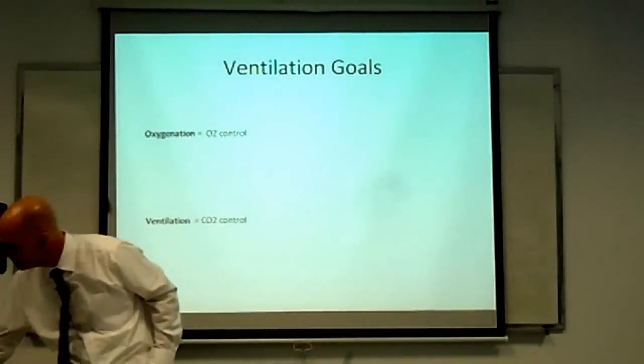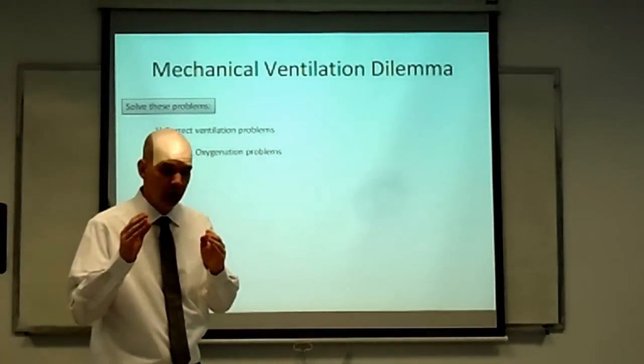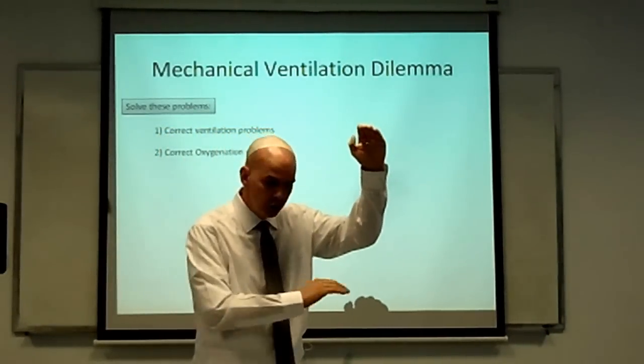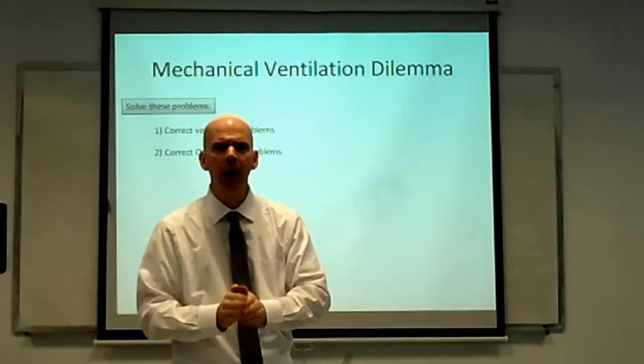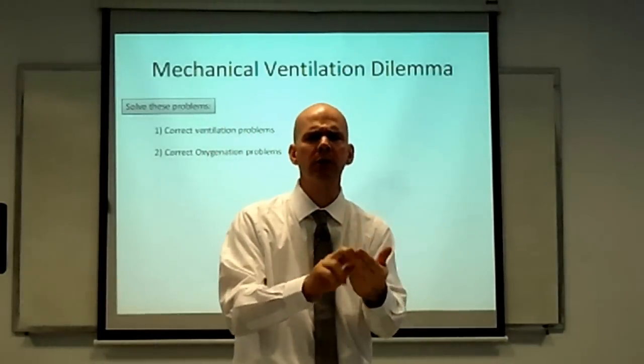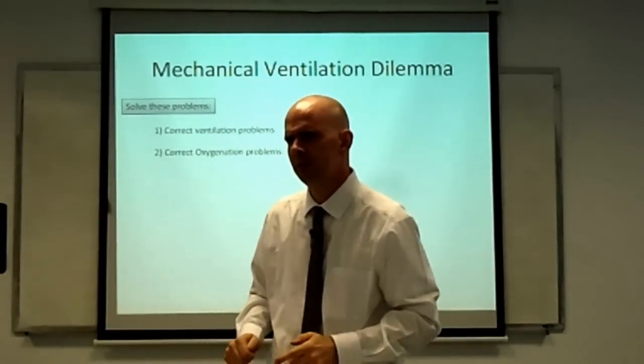And you know what? Positive pressure ventilation will do this for us. It says, hey, you want O2 up? You want CO2 down? I will provide these services for you. And you know what? I will give them to you in a convenient, practical, easy-to-use package. There is just one catch, though.